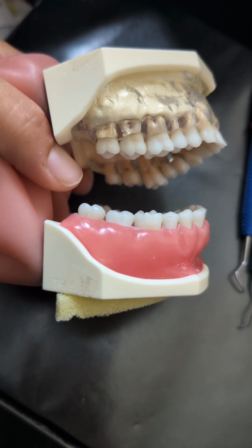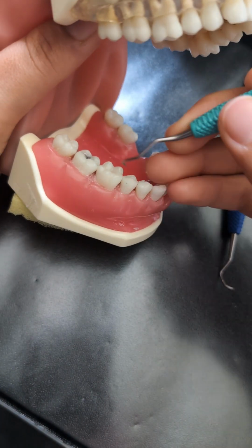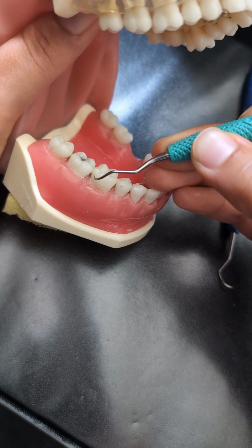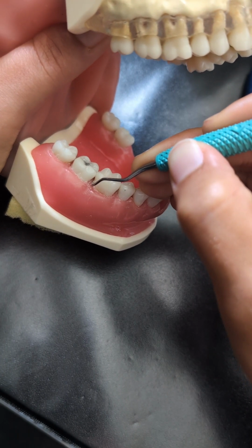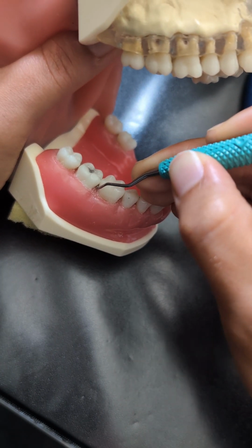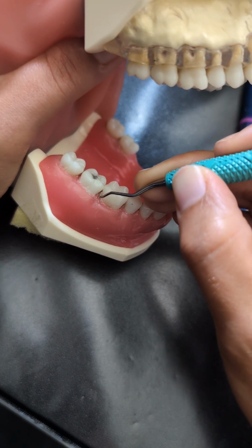Okay, now how are we going to use these instruments? The same as with the universal. P to the D, we're going to close, 0 to 40 degrees, we're going to insert, we're going to open, and because this instrument is already angled 70 degrees, we don't have to angle this instrument, because as long as the lower shank is parallel to the long axis of the tooth, the working angle is already created.